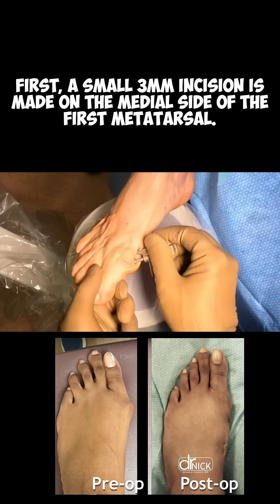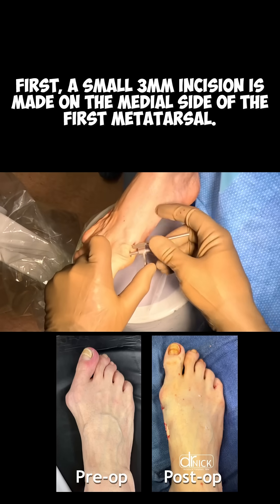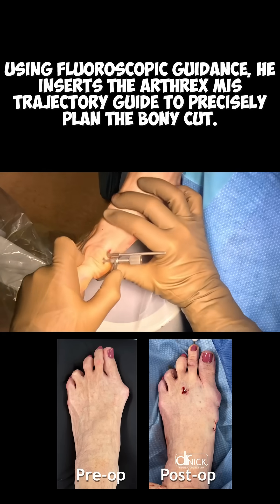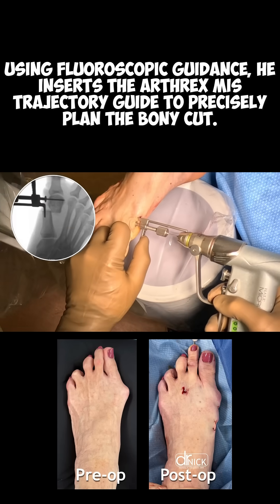First, a small 3mm incision is made on the medial side of the first metatarsal. Using fluoroscopic guidance, he inserts the Arthrex MIS trajectory guide to precisely plan the bony cut.